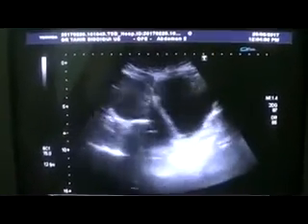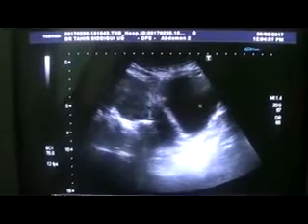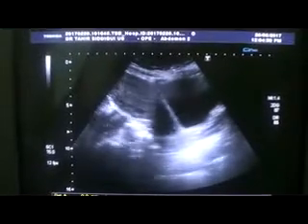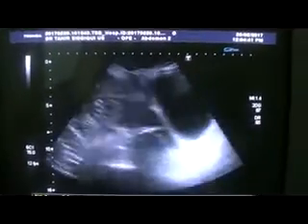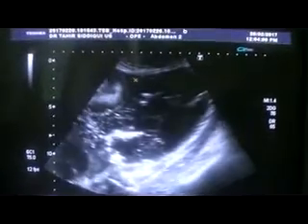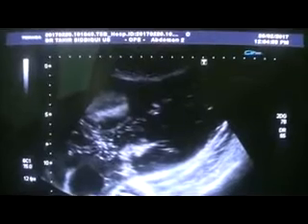First ultrasound being performed. Urinary bladder in longitudinal section, the cervix, the uterus, the endometrial canal — this is the longitudinal section. From here, expanding on both sides of the midline and extending up to the epigastric region, you will see a complex cystic mass.